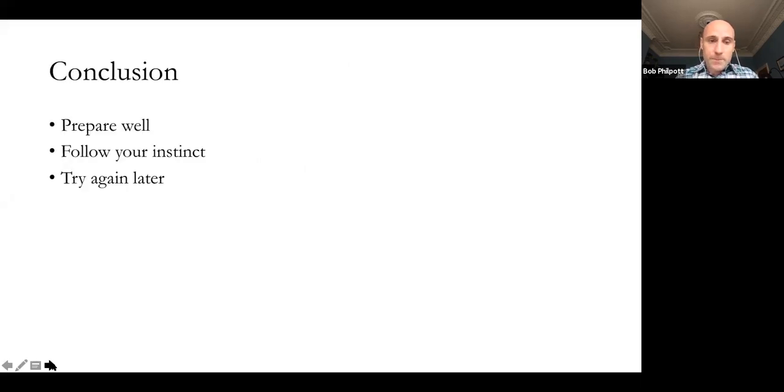So in conclusion, I would say prepare well. So stand on the tee and swing the golf club several times. Look at the radiograph. I find myself when I'm about to access, looking at a radiograph, looking back at the tooth, looking at a radiograph, looking back. Do that a few times. Follow your instinct, so that when I showed you the image from Paul McCabe's paper of the canal being calcified and it just being there and you knowing that it's there, follow your instinct. And equally, if you think I'm going a bit too deep here, stop, take an intraop radiograph and follow the map that is there as well.